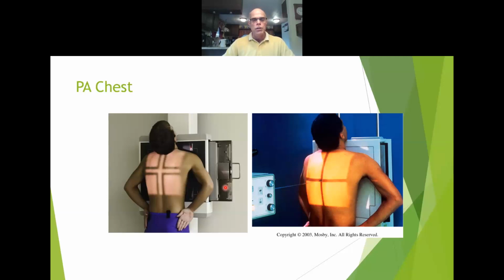It's a medical procedure. It's nothing to laugh about, nothing to be ashamed of or embarrassed about. But this is something very important. You can even explain to the patient why this is necessary, because we don't want breast tissue to look like a disease process, and we also don't want breast tissue to obscure the possibility of any type of pathological condition. It says this is especially important when ruling out the presence of fluid. Have the patient hold the breast in place by leaning against the IR.